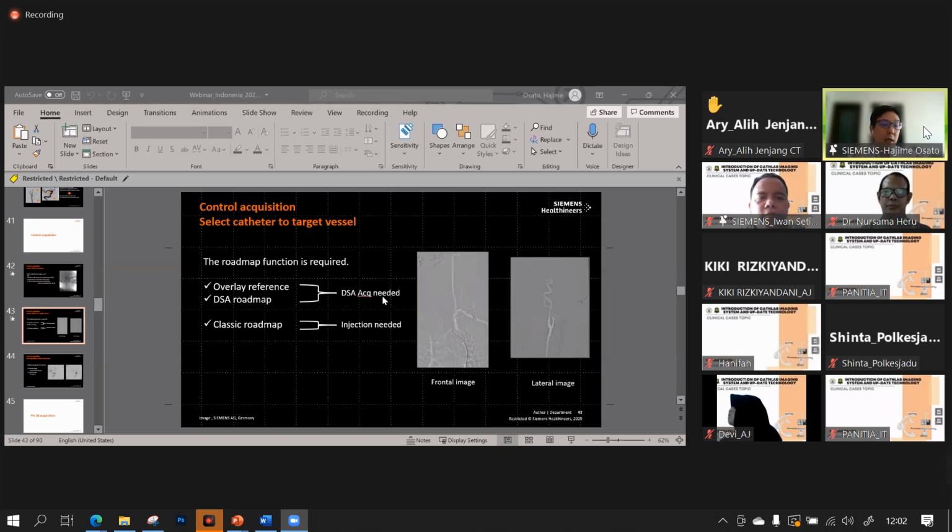The system detects the patient motion and calculates each frame using the raw data and the interpretation of the motion signal as well as possible. In the latest software version, we have motion artifact correction for 3D imaging. Okay, thank you.